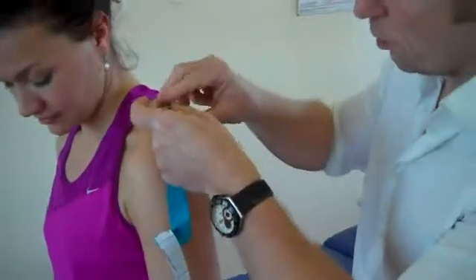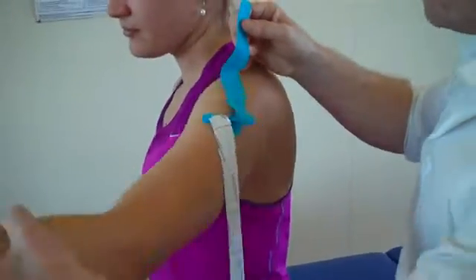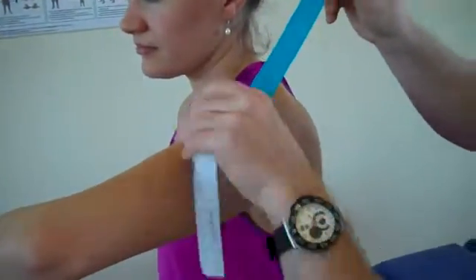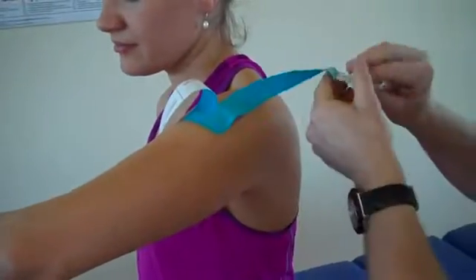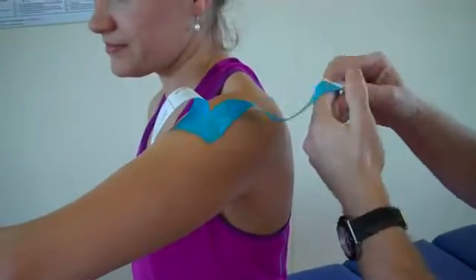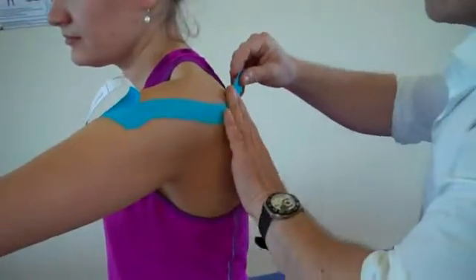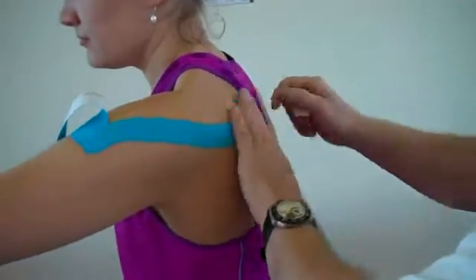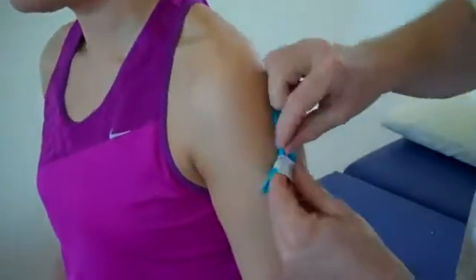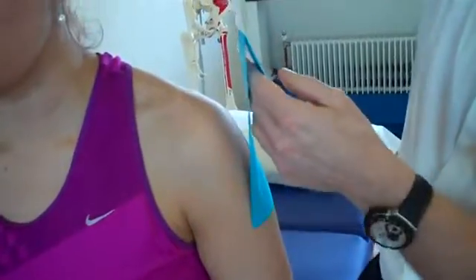Make sure that's sticking on there. We're going to use the shoulder and lengthen the posterior deltoid. Bring your arm forward and then slowly turn your arm in. We've got some stretch onto the posterior aspect of the deltoid, and then this first leg is going to come around with no stretch onto the tape, because the tissue's already on stretch. We're literally going to feed that around and curl it around with no stretch on the ends. That's working on the posterior aspect.